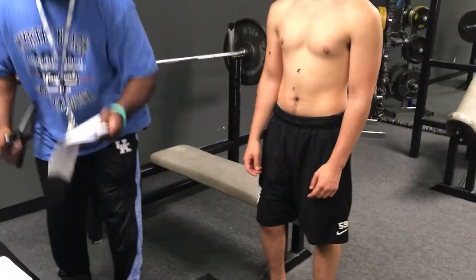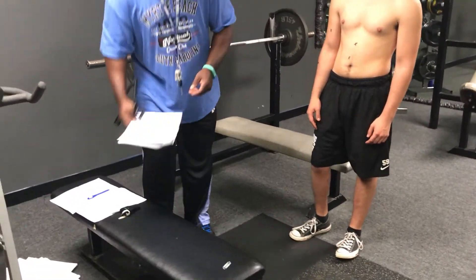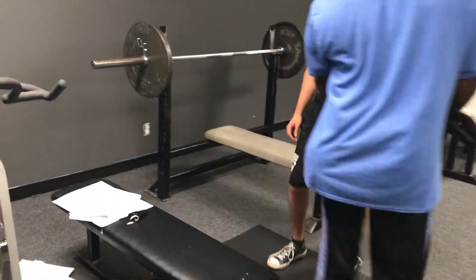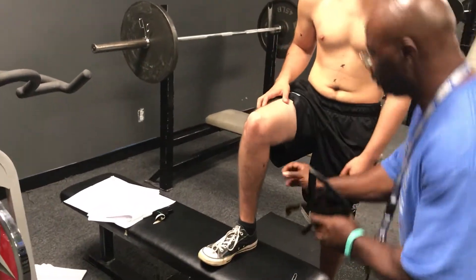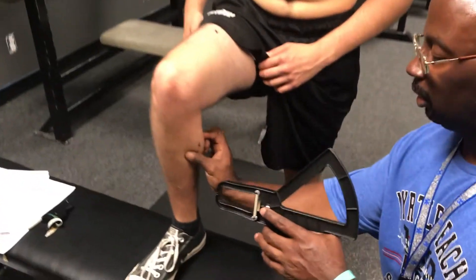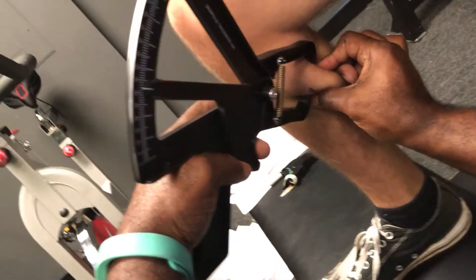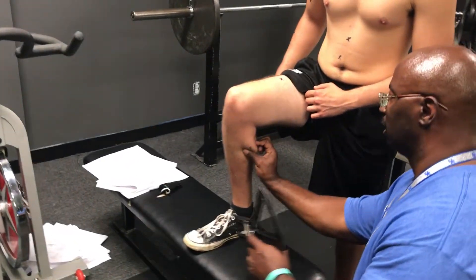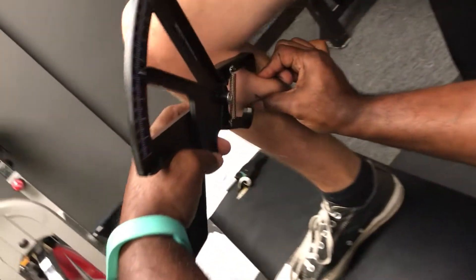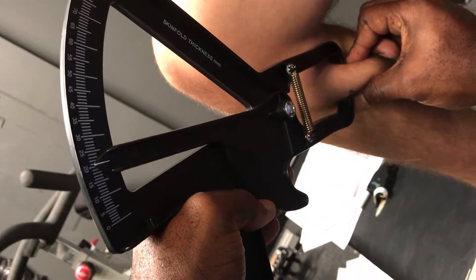Next is your calf. I'm going to do the midline of the medial aspect of your calf. Put one leg up so I can measure. Right at 20. I'm going to take it again — looks like 20 again. Excellent.